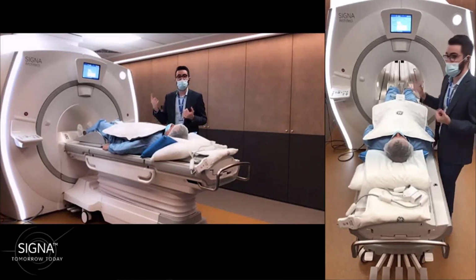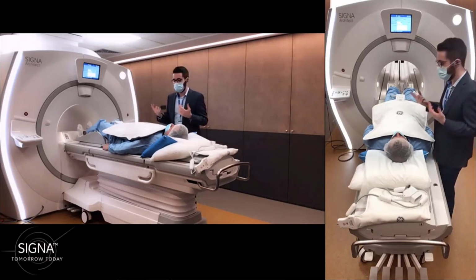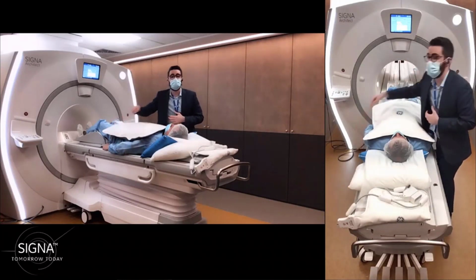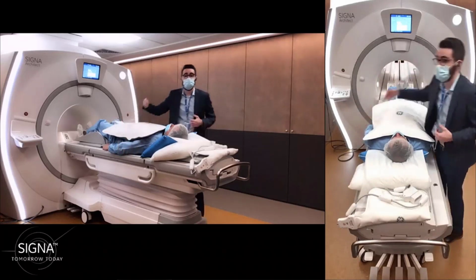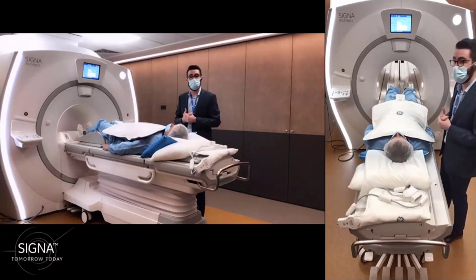I will just need now to create the landmark. For that, I will use the IntelliTouch, which is the sensitive strip band that you can find on the side of the table. With only one finger, by pressing on the side of the table, I will create the landmark and send the patient within the bar.